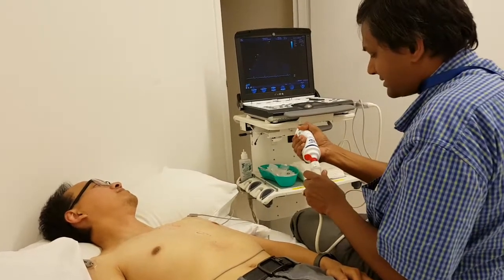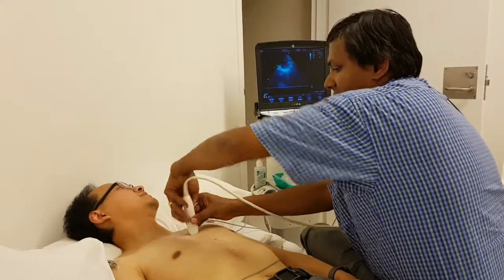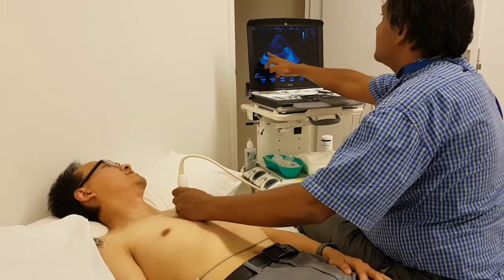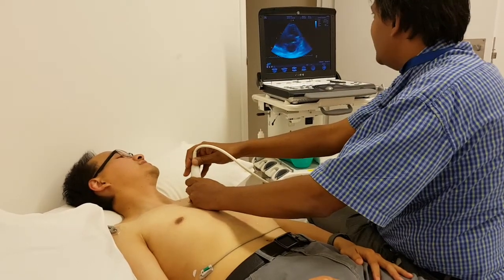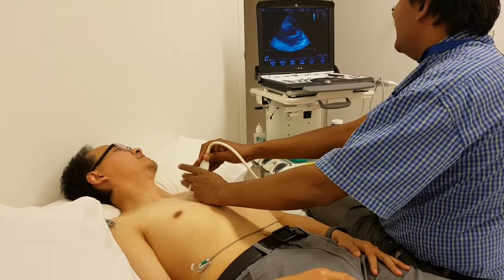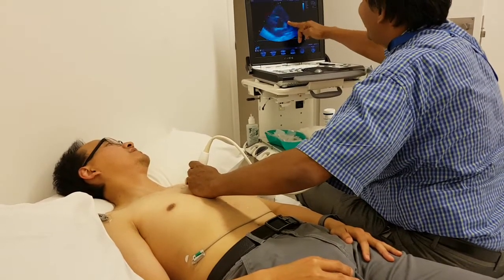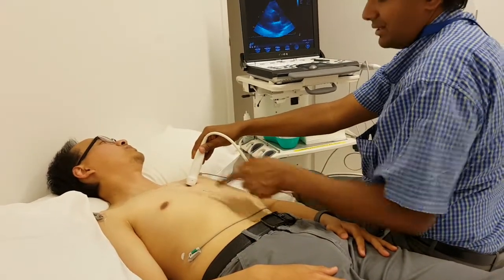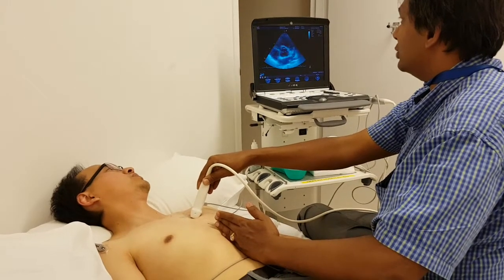If I want the same thing from the parasternal view — so taking the probe there — that's the mitral valve. Let me decrease the depth. That's the right atrium, the tricuspid valve, in between the aortic and the mitral. Let me get the aortic valve view by tilting a little bit more anteriorly, going from the oblique view to the proper view. Now you can see the right atrium, tricuspid valve, right ventricular outflow tract, the pulmonary valve and pulmonary artery. From the subcostal we got a much better, longer shot of the pulmonary artery.